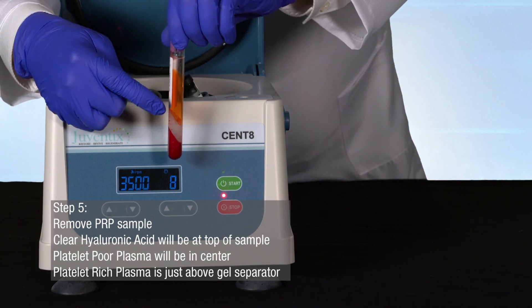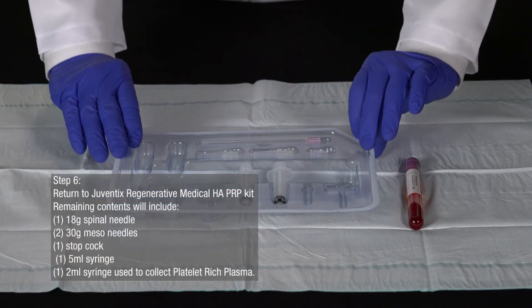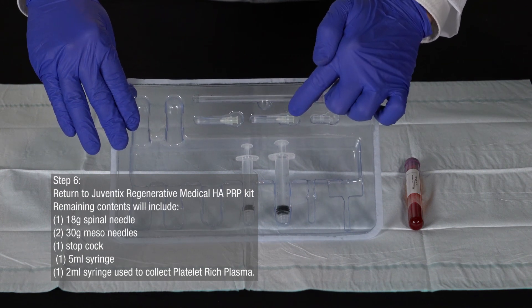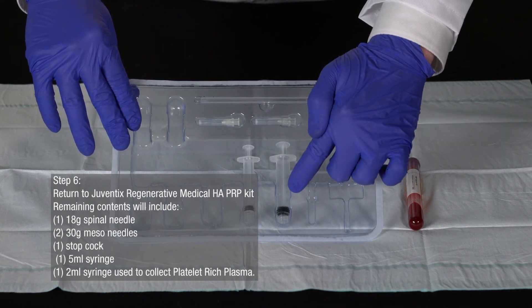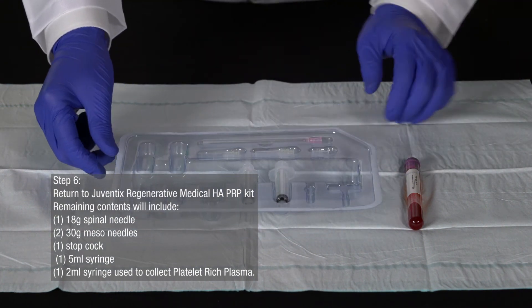Return to your Juventix Regenerative Medical HAPRP kit. The remaining contents will include one 18-gauge spinal needle used to draw the prepared HAPRP from the tube, two 30-gauge mesoneedles used to vent the tubes of prepared HAPRP, one stopcock used to transfer HAPRP between two syringes, one 5-milliliter syringe used to collect platelet-poor plasma, and one 2-milliliter syringe used to collect platelet-rich plasma.